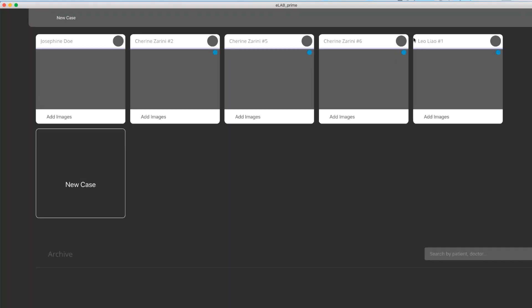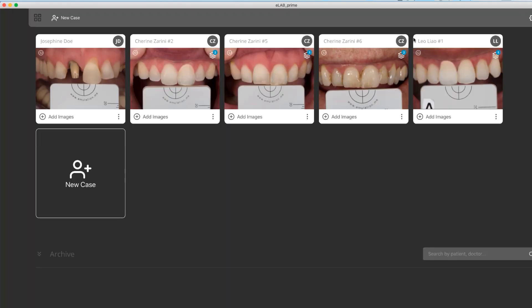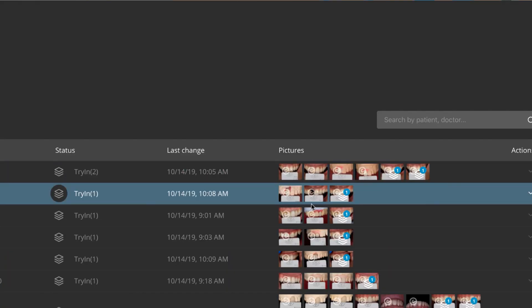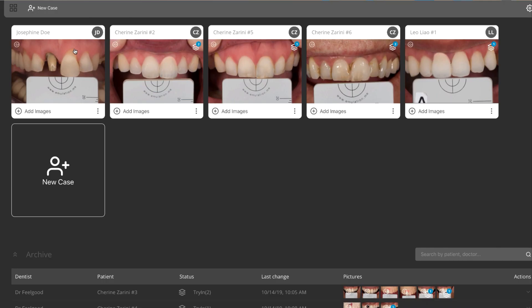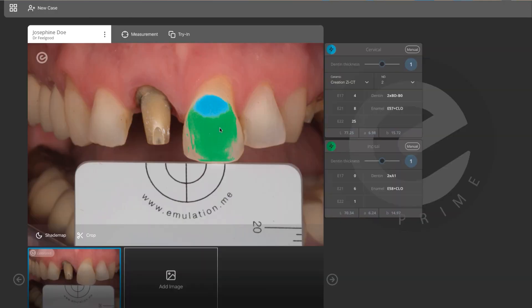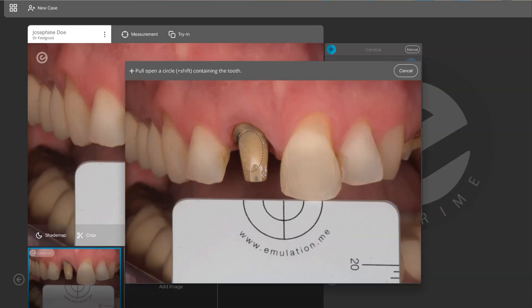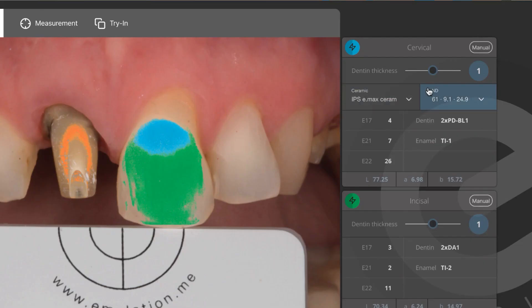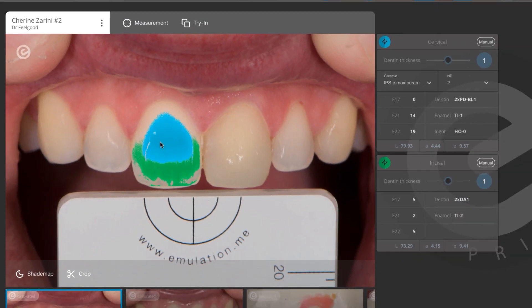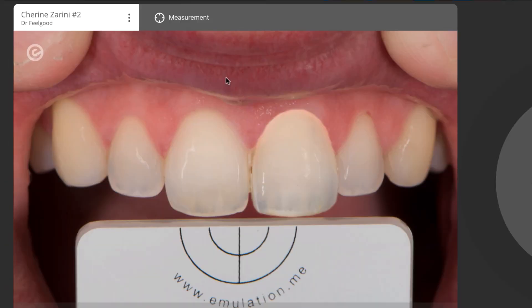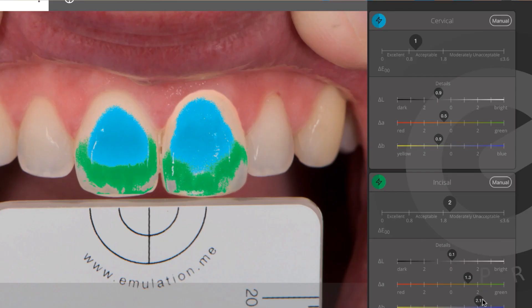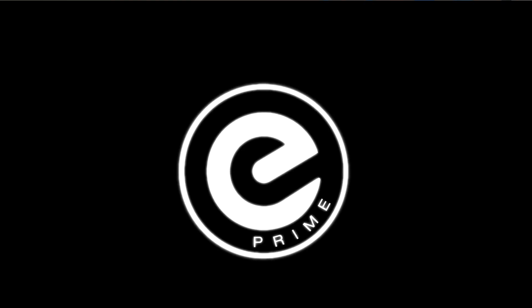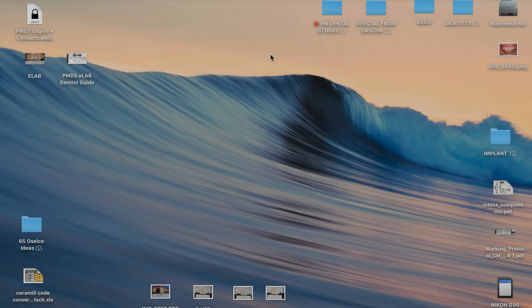Hi everybody, the brand new eLAB Prime is now available for everyone, so we decided to share with you a couple of videos with some tips and tricks. eLAB Prime is very intuitive and easy to work with. My name is Peter and I will take you through a case I finished just yesterday, so let's get started.